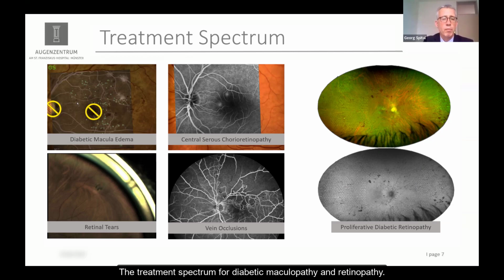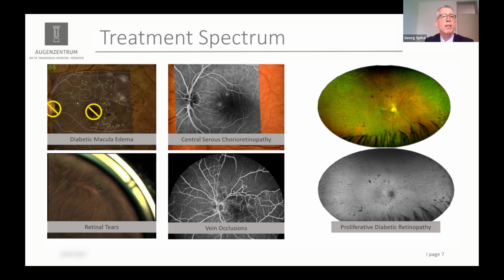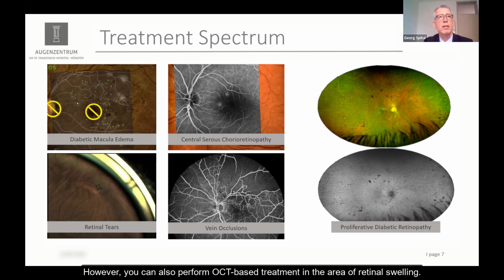The treatment spectrum for diabetic maculopathy and retinopathy. In diabetic maculopathy, non-contact laser treatment is carried out and the microaneurysms can be used to guide it angiographically or clinically. However, you can also perform OCT-based treatment in the area of retinal swelling.